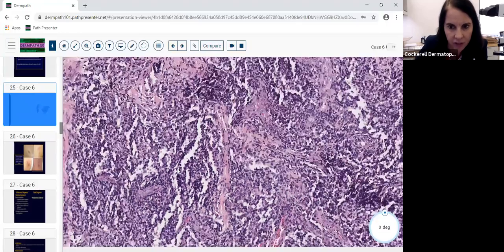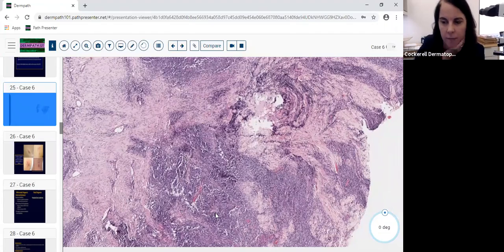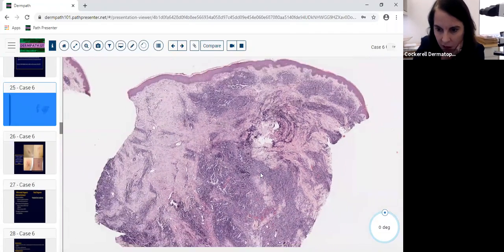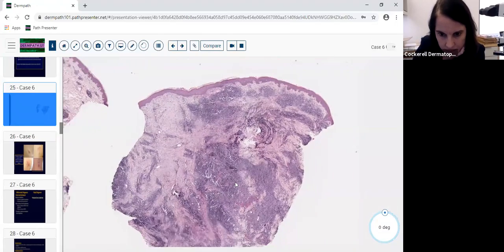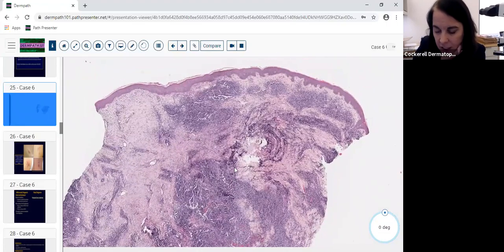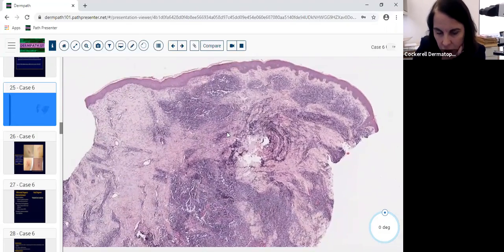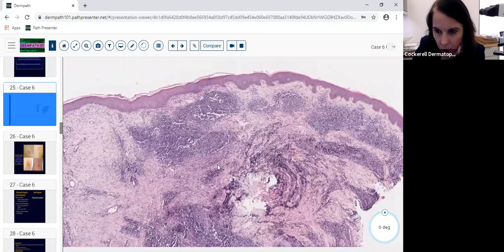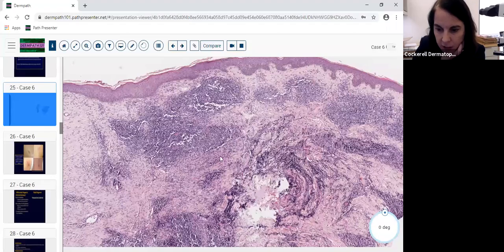And that's why we have to be very suspicious here of an atypical cutaneous lymphoproliferative process. In the past, we used to say that, oh, well, it's bottom heavy, and that's a sign of malignancy, but you really shouldn't do that because you really have to work toward proving clonality. But this is a definite diagnostic dilemma for many pathologists, and everyone's trying to figure out a good way to be able to determine what type of lymphoproliferative process this is, and to rule out a benign process and rule in a malignant process, and what type of malignant process.